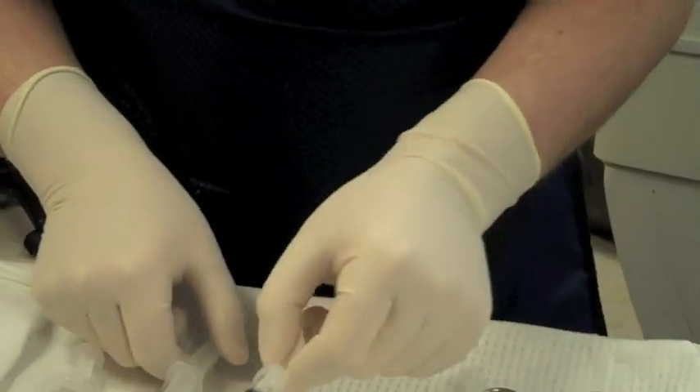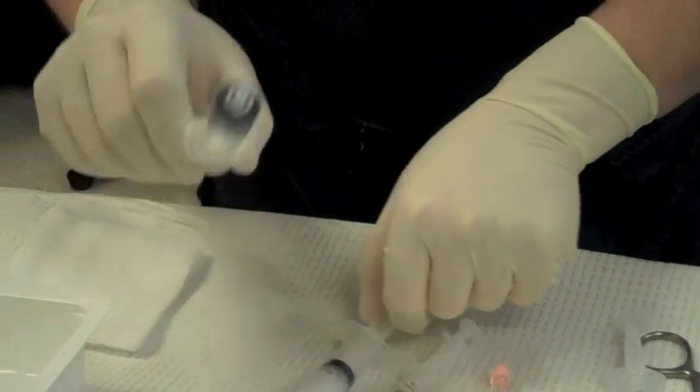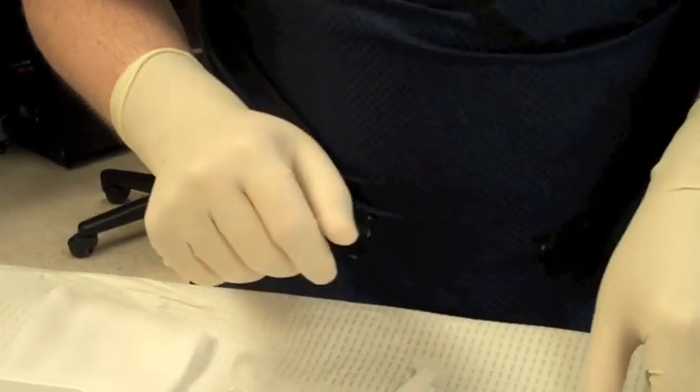We use contrast medication. We use a local anesthetic with a steroid type medication. And then we use an enzyme which is called hyaluronidase, which also breaks up scar tissue.